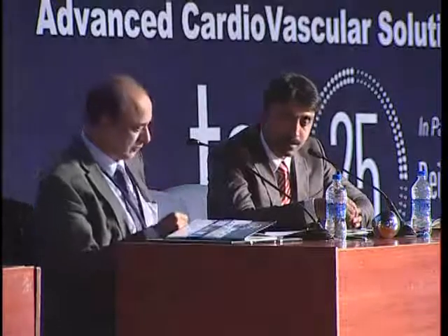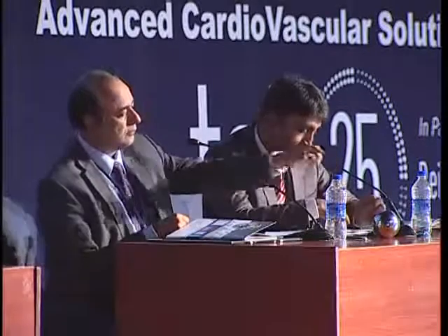Dr. Kirti, I have one question. In your practice of CTO retrograde techniques, do you routinely use CT angiogram to evaluate the microchannels before you attempt the procedure? No, the answer is no, I do not do that routinely.